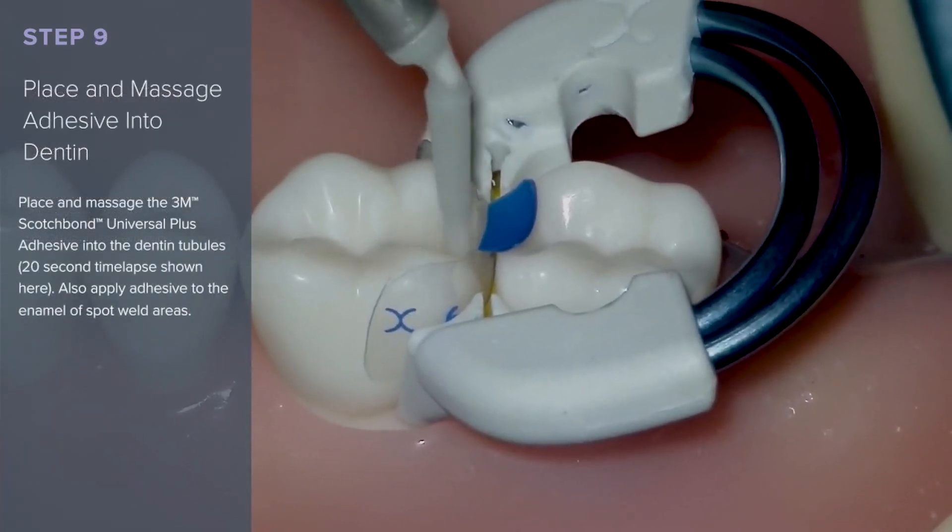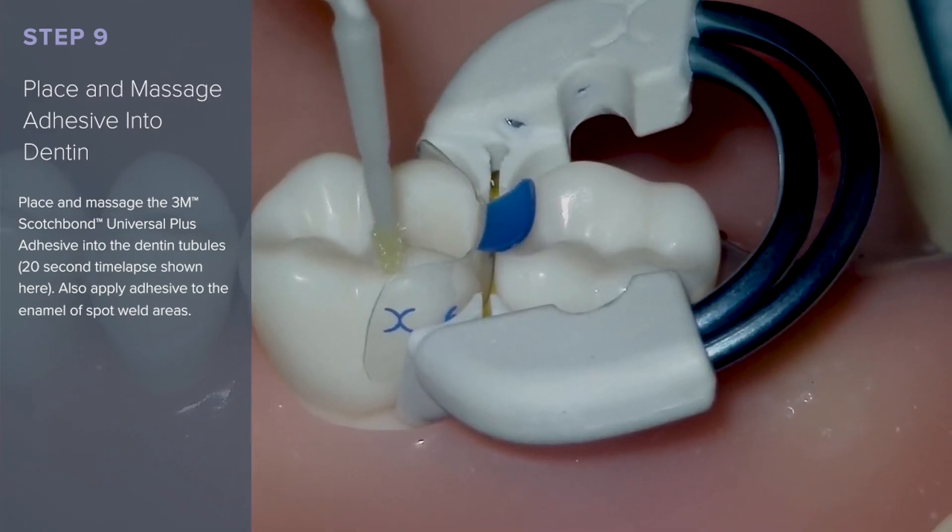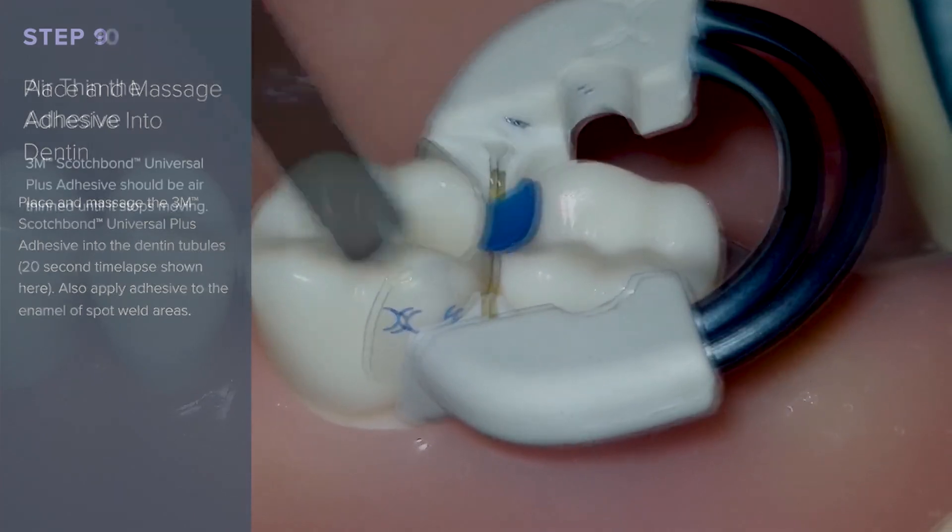Place and massage the 3M Scotchbond Universal Plus adhesive into the dentin tubule areas for 20 seconds. Then air-thin the adhesive.